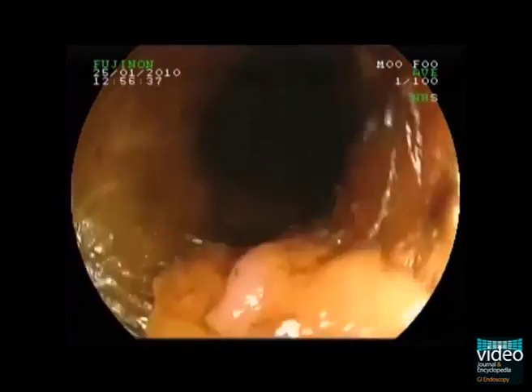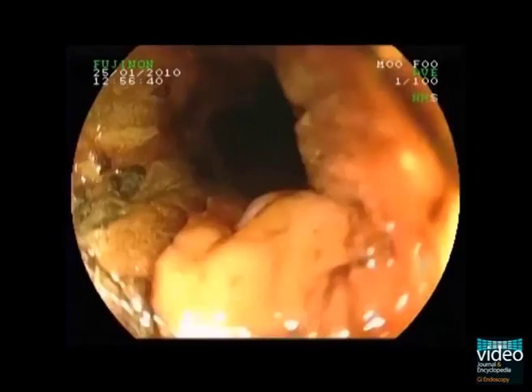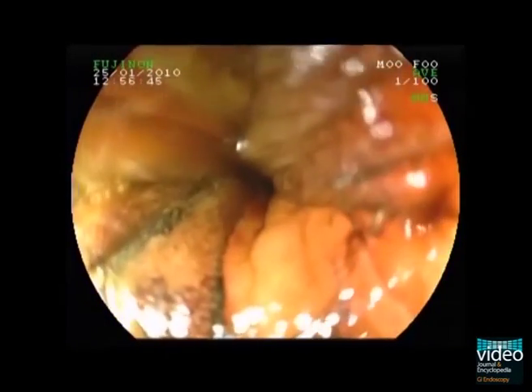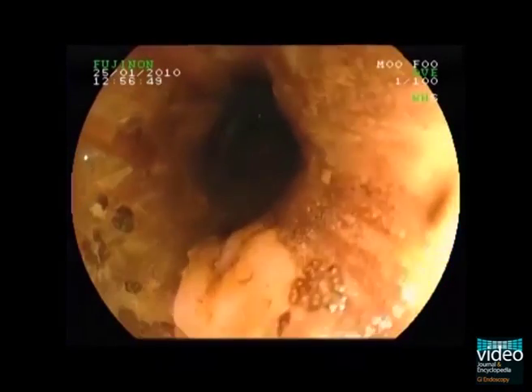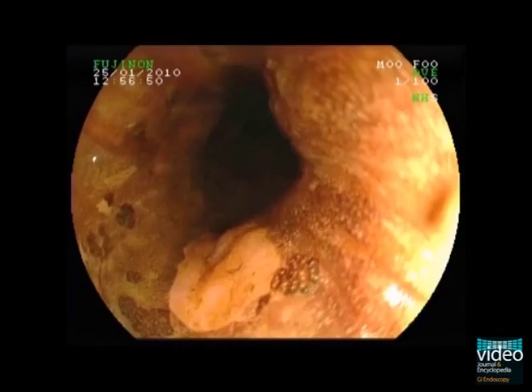Dye-based chromoendoscopy with Lugol's solution stains normal esophageal epithelium brown, while heterotopic gastric mucosa is not stained, thereby enabling exact demarcation of the gastric inlet patch to the surrounding esophageal tissue.